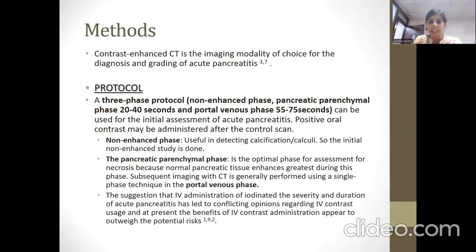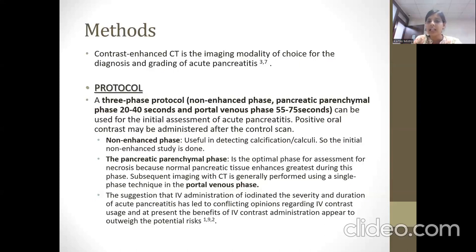Protocol: three phases are taken — non-enhancing phase, pancreatic phase at 20 to 40 seconds, and portal venous phase at 55 to 65 seconds. The non-enhancing phase is useful in detecting calcification or calculi. The pancreatic parenchymal phase is optimal for assessing necrosis because normal pancreatic tissue enhances greatly during this phase. Subsequent imaging with CT is generally performed using a single-phase technique in the portal venous phase.